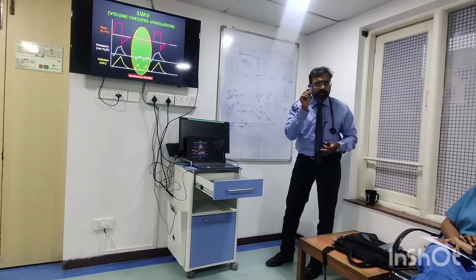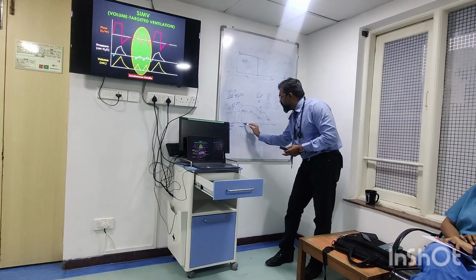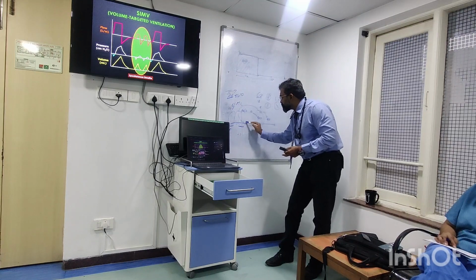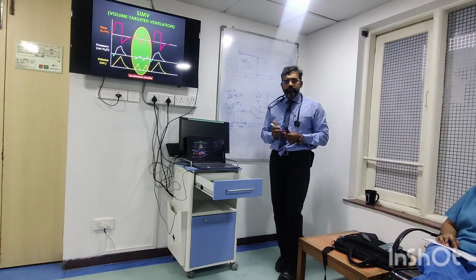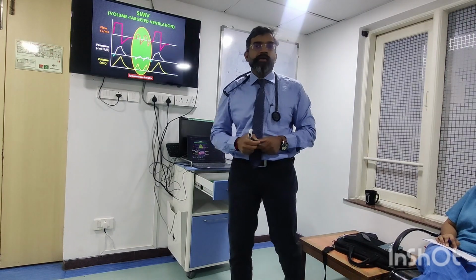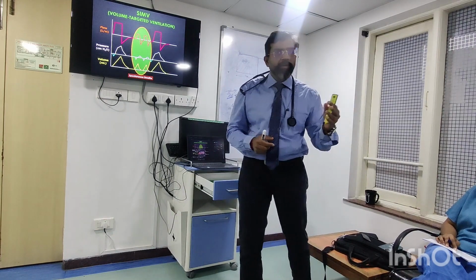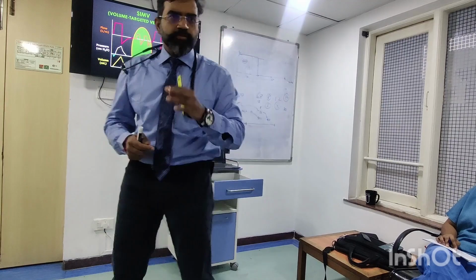That's why we are calling it limited by volume. After that, what happens? All this part is going to be the patient's own breathing. In that period, it won't deliver that volume. You understand? Clear on this? SIMV period and mandatory period. That is what you must remember.